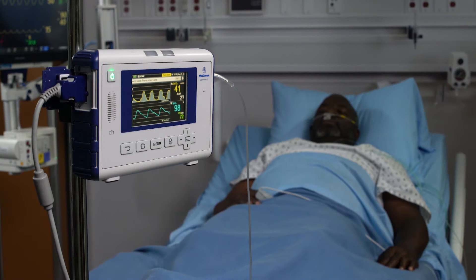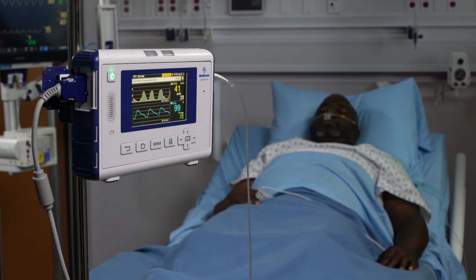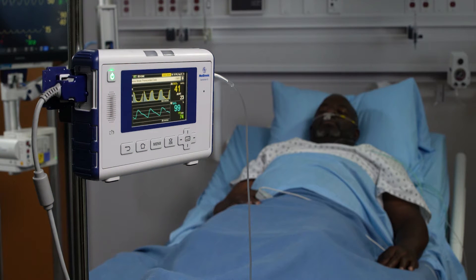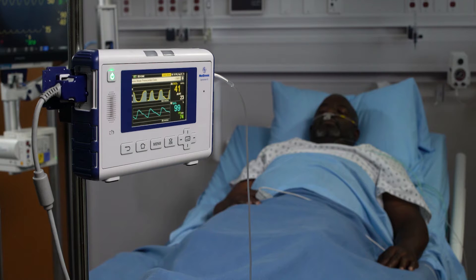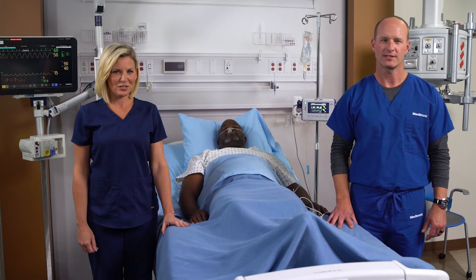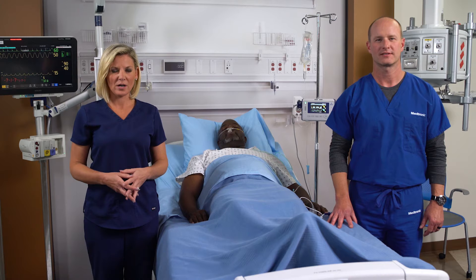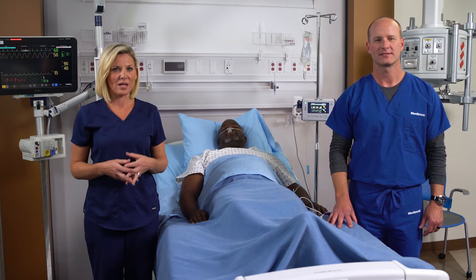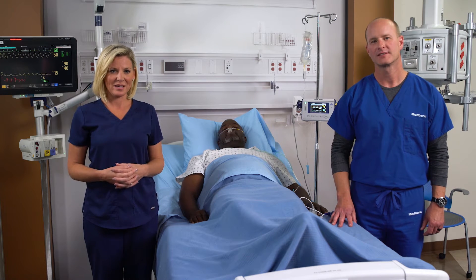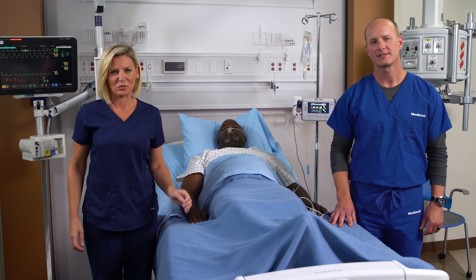You want to remain vigilant about your patient's safety, but with so many distracting alarms that aren't clinically significant, it can be hard to stay focused. Your institution determines the type of software and algorithms that are on your monitor, so you may or may not have access to alarm management tools. Microstream capnography smart alarm management algorithms are engineered to help reduce such distractions and may lead to improved patient safety.